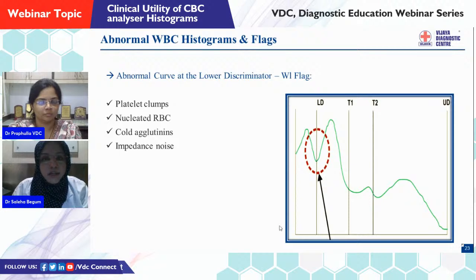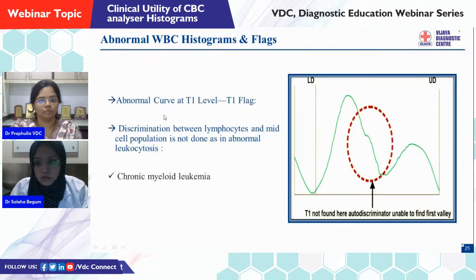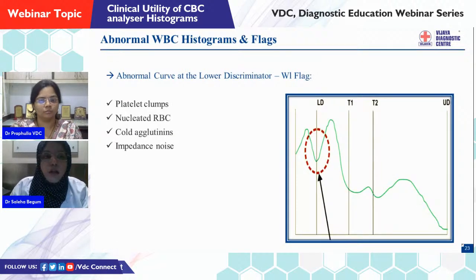So here, this is a second variation of the normal WBC graph. Here you can again see the graph is not starting at the baseline. Instead, it is starting somewhere in the middle, indicating that the lower discriminator is unable to discriminate between a small lymphocyte population and a population that is even smaller than a lymphocyte, which is present in significant numbers. So what could be the causes of such a WL flag? It is either platelet clumps, nucleated RBC, cold agglutinins, or high background noise such as impedance noise in the automated analyzers. Any of these reasons could present as a WL flag, meaning the graph is not starting at the baseline.